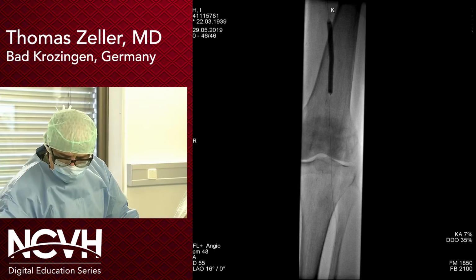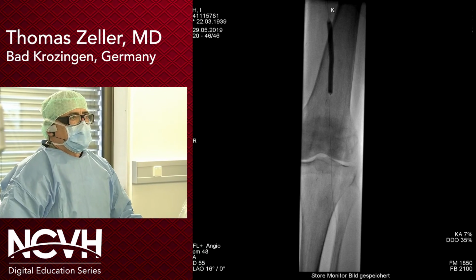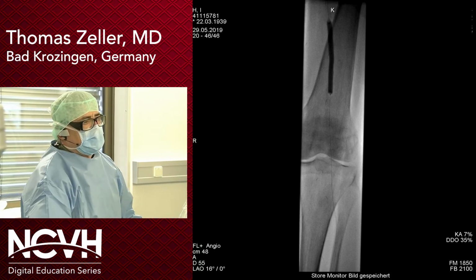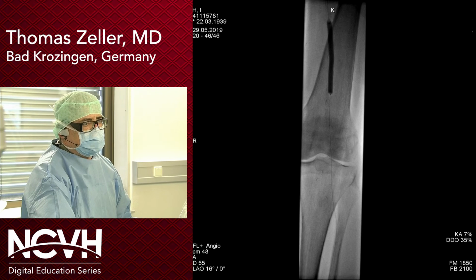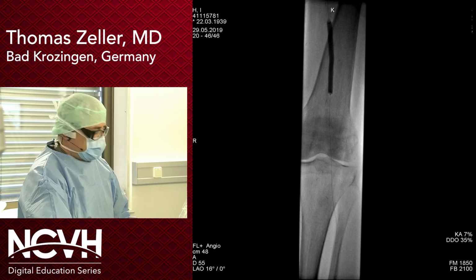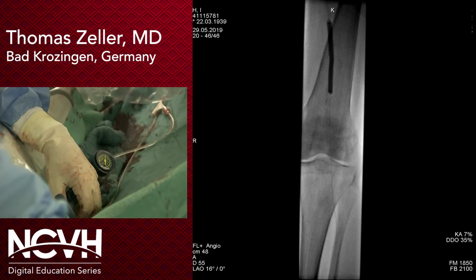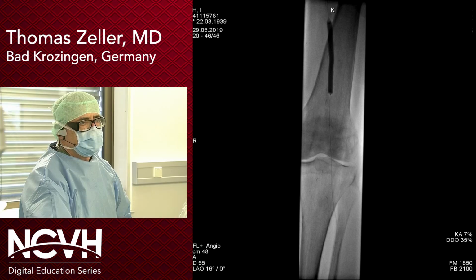That's great. What size balloon are you planning on using in the BTK space? She's very small, a tiny lady, so I will use a 2.5 millimeter balloon, and we have a special balloon available which is 30 centimeters in length, so I'm more or less able to cover the entire anterior tibial with one single drug-coated balloon here. Nice. This is my intention, yeah.